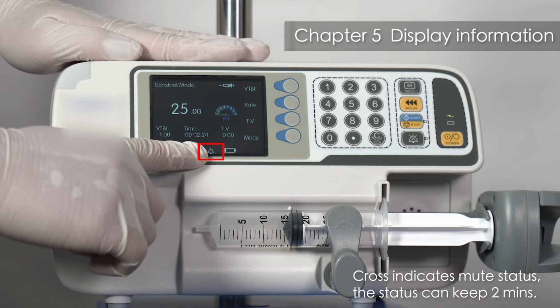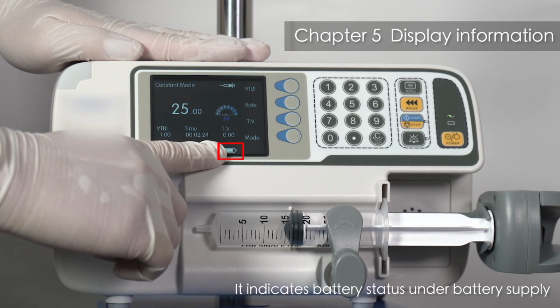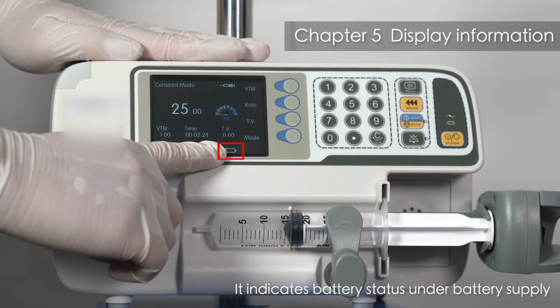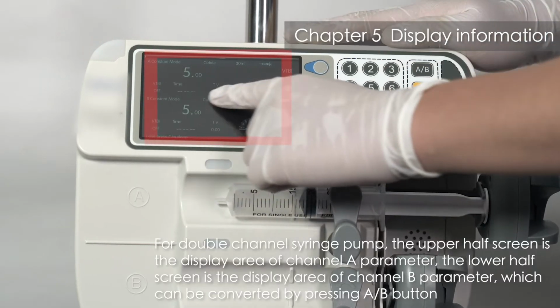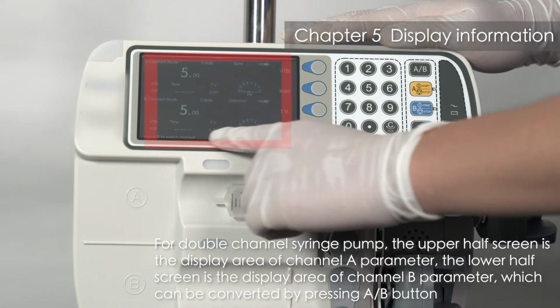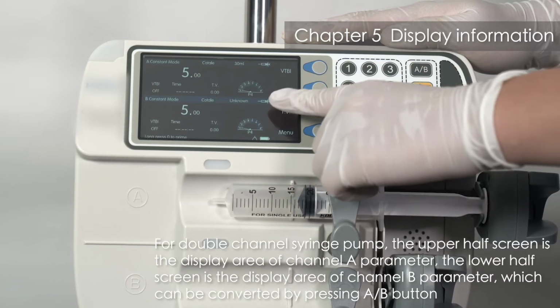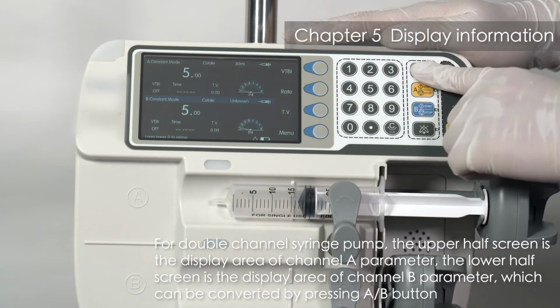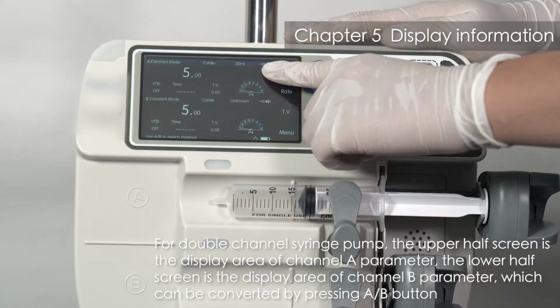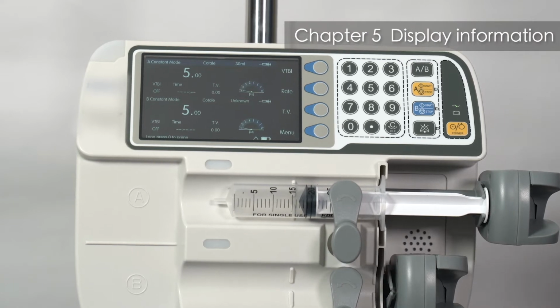Cross indicates mute status. The status can keep 2 minutes. Battery icon. It indicates battery status under battery supply. For double-channel syringe pump, the upper half screen is the display area of channel A parameter. The lower half screen is the display area of channel B parameter, which can be converted by pressing the A-B button.